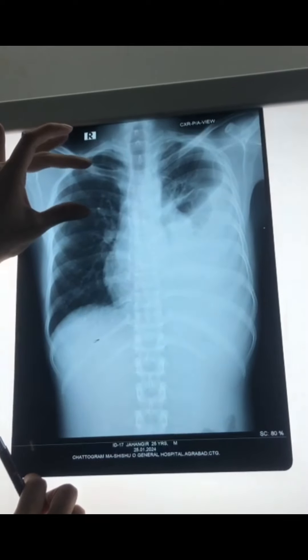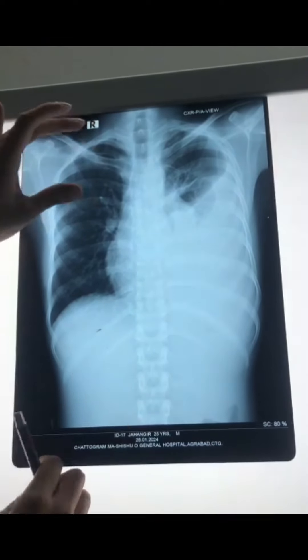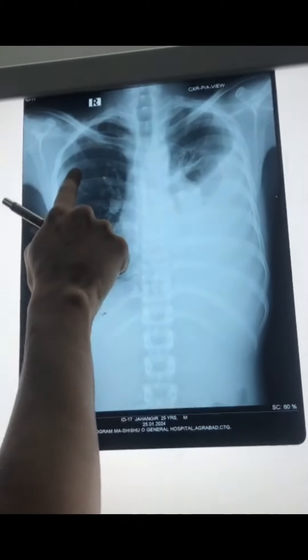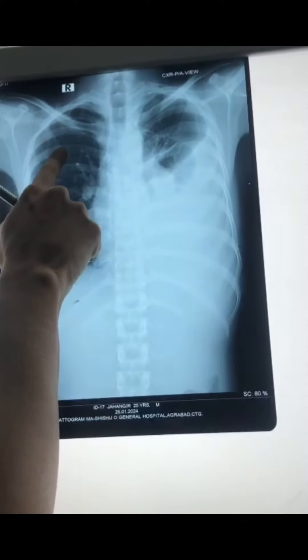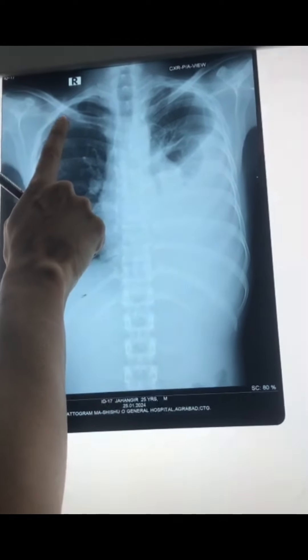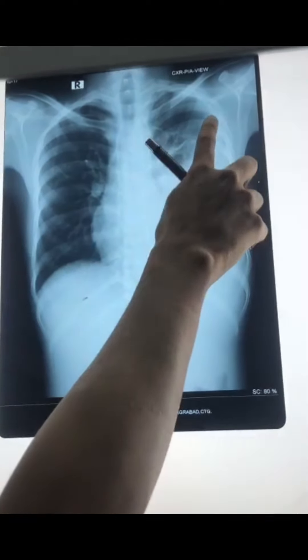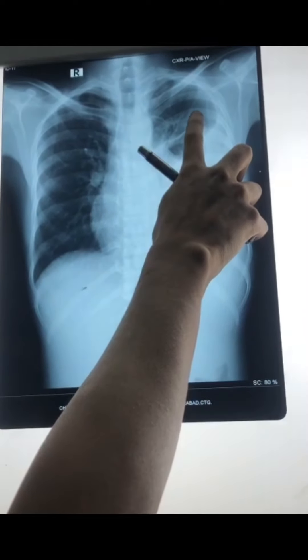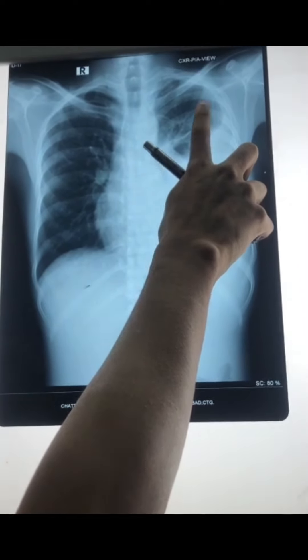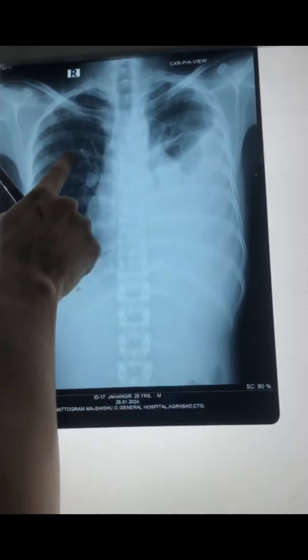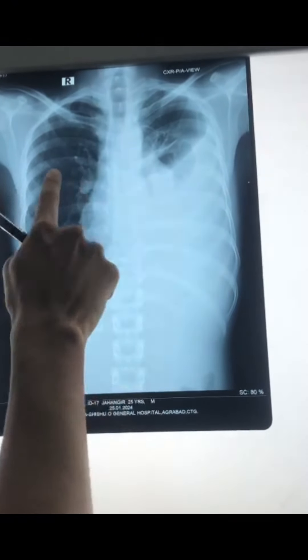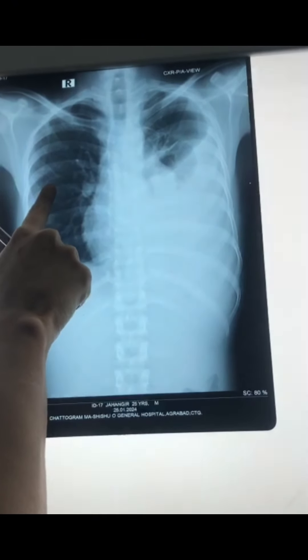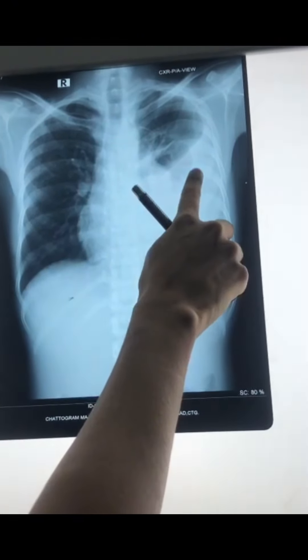Then we will compare the upper zone. We compare the upper zone on the left and the right. Then we compare the middle zone on the left and right side as well.